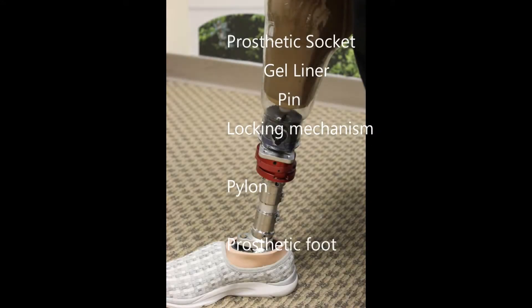Basic understanding of prosthetic terminology will be helpful. For our instruction we will use a temporary test socket. Test sockets are clear plastic devices used for diagnostic purposes. Using a test socket in these videos will help us illustrate the way in which the pin and locking mechanism interact.